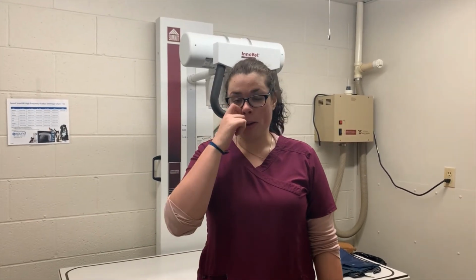Alright, for our contrast study, we're going to be doing a barium study on Willow. Willow is 55 pounds, so she's about 25 kilograms. Our barium says to give 5 to 7 mils per kilogram, so Willow's going to get about 125 mils altogether.